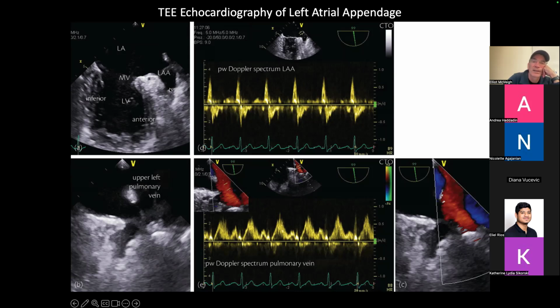It's right here. That, for people who are in atrial fibrillation, that little pocket tends not to empty. So blood goes in there and it stays in there for a long time, right? We'll see a very good CT description of the shape of this chamber. And what you want to do is evaluate whether or not there is a thrombus inside the left atrial appendage.